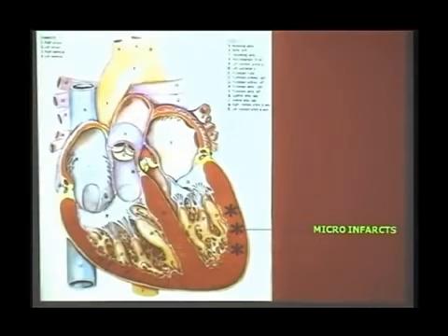It will prevent an infarction. So the patient will not have a Q wave because the artery is opened up before the infarct has happened. But some amount of ischemia will be there because the artery occlusion was there. So some patients, when they come to you after 2 to 3 days of chest pain, will not have Q wave, will not have ST elevation, they will have only symmetrical T wave inversion, which indicates significant ischemia.